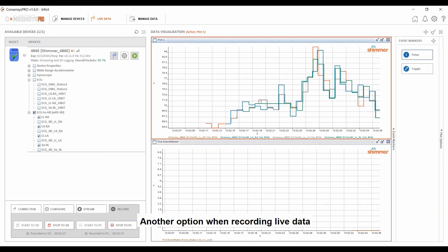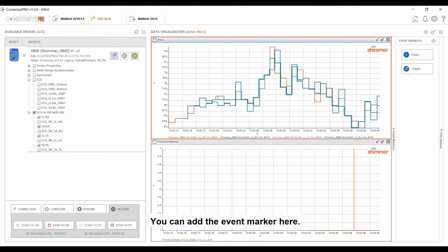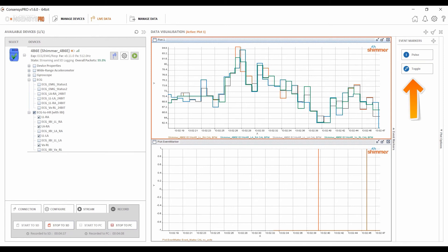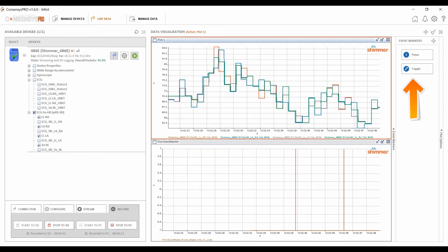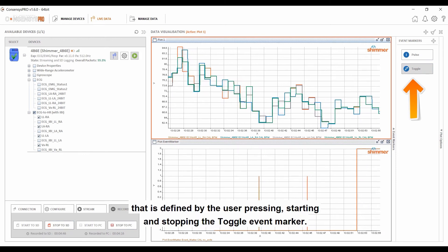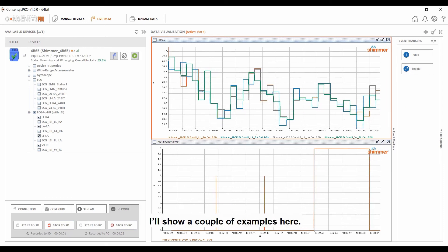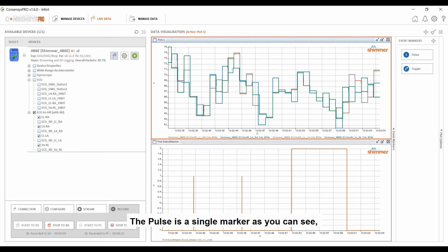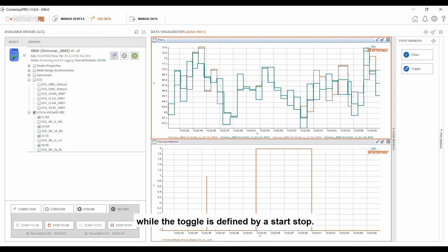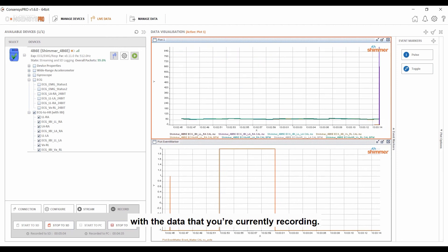Another option when recording live data is to add event markers to highlight moments of interest. You can add the event marker here. There are two types of event markers: the pulse adds a single marker to the data, while toggle sets the event marker over a period defined by the user pressing start and stopping the toggle event marker. The pulse is a single marker, while the toggle is defined by a start-stop. These event markers are time correlated with the data that you are currently recording.